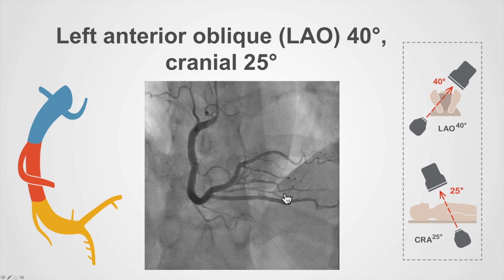Here on the frozen frame we can go through things again. I want in this view you mainly to concentrate on the distal right coronary artery, which is being highlighted here. Can you see how much the bifurcation has been opened up in this view? The superior branch again is the posterior left ventricular branch, and these are branches from this posterior left ventricular branch. This branch here is the posterior descending artery, which is easily seen.